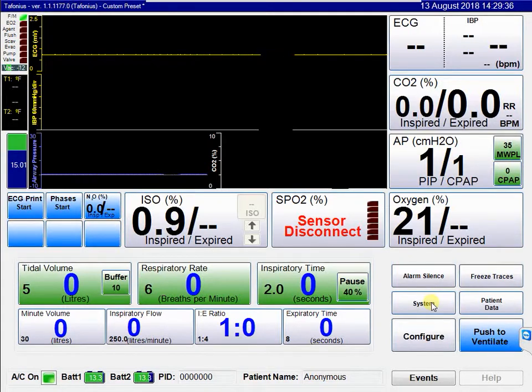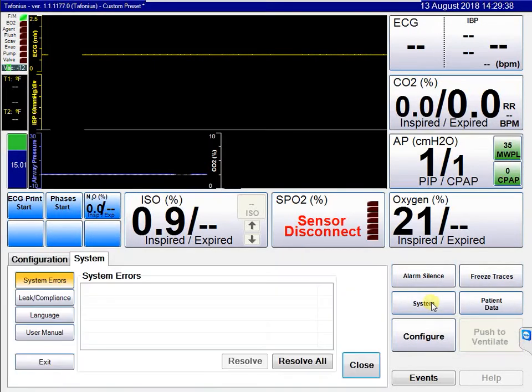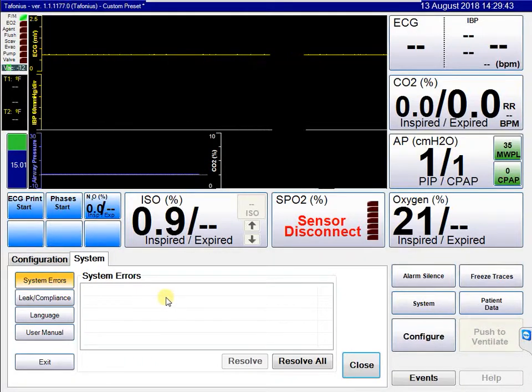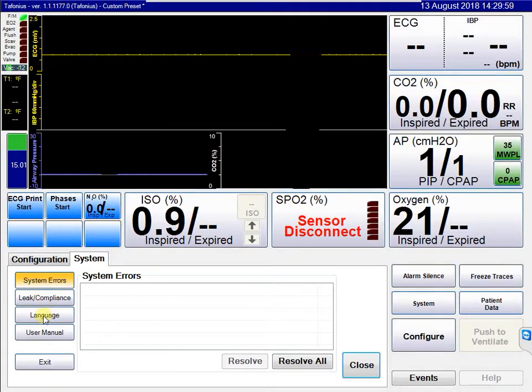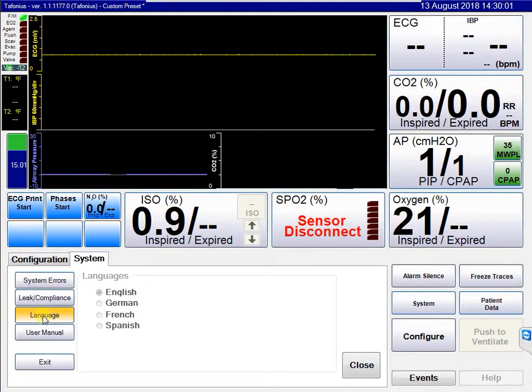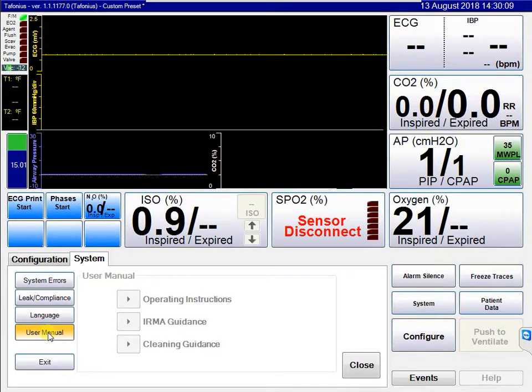The system button can be used to access and control parts of the system. Clicking on it, you have a system errors box where any errors will appear in full detail. Below that is the leak and compliance option, seen in a previous video, which allows you to perform a leak and compliance test. Below that is the language option, which currently defaults to English, and the user manual button, which is not yet fully completed, so those options are greyed out.